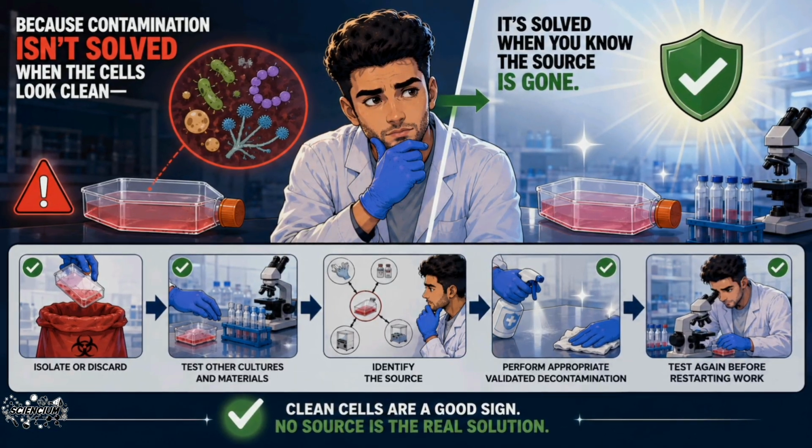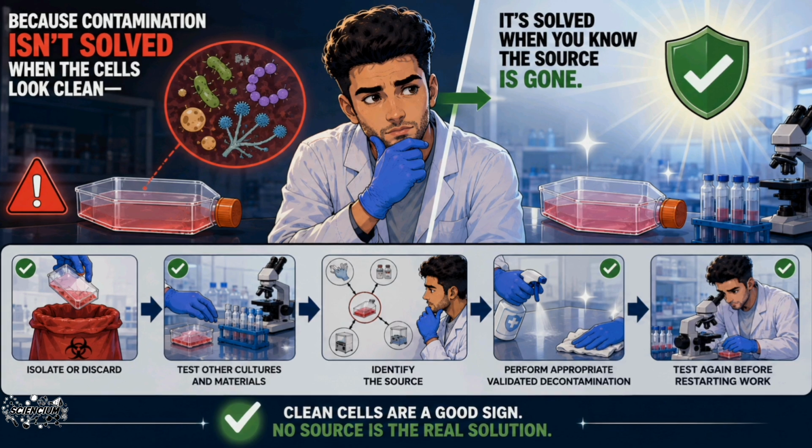Because contamination isn't solved when the cells look clean. It's solved when you know the source is gone.